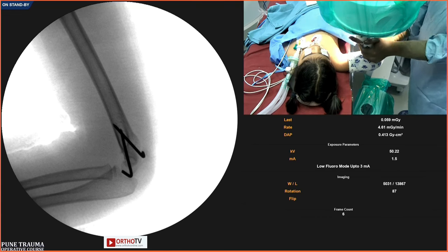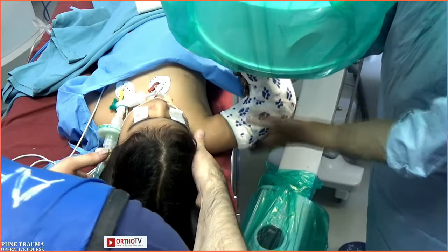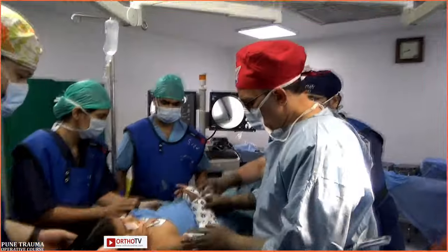And so supracondylar fracture is 80% reduction and 20% fixation. I think, Sandeep, you won the battle when you got the best reduction. Yes. I think the wires just had to hold it.